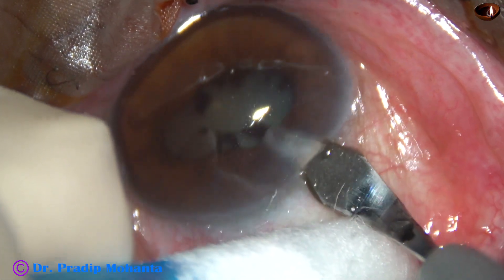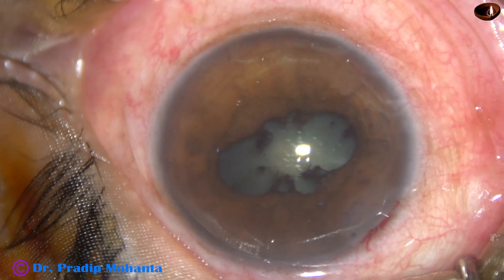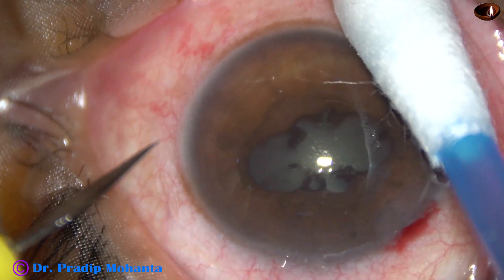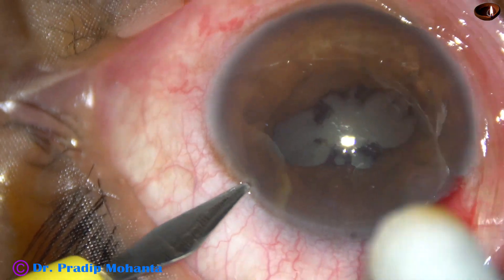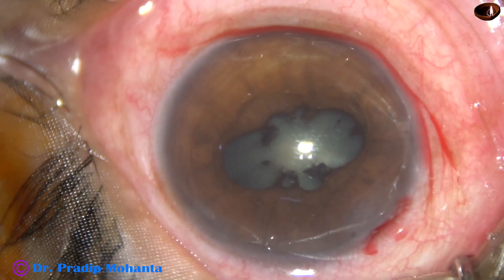This is the main incision with a 2.8 mm steel keratome. Only one side port has been done in this case, about 3 o'clock hours away from the main incision. This is the side port.